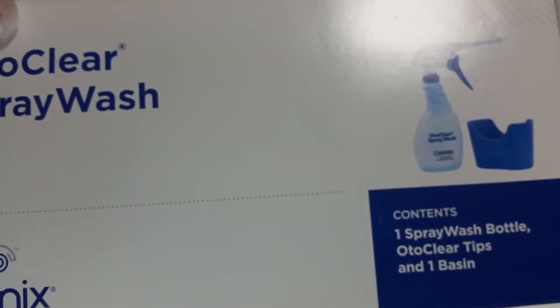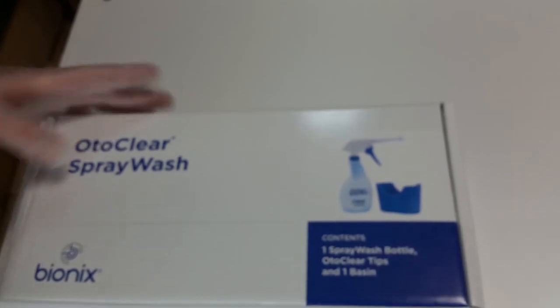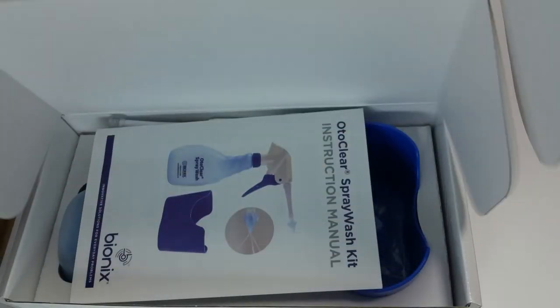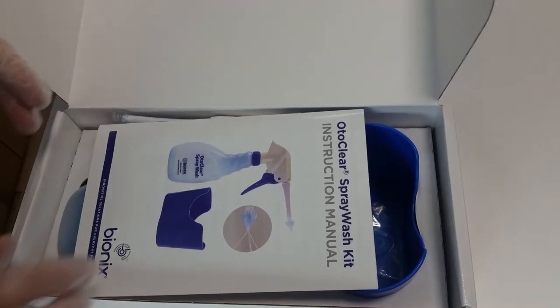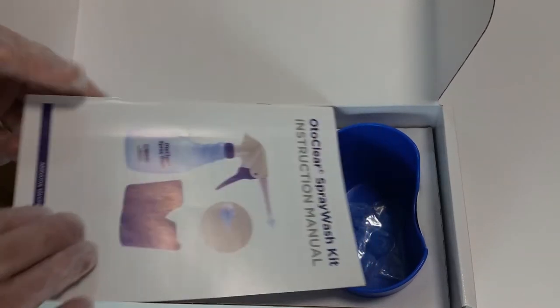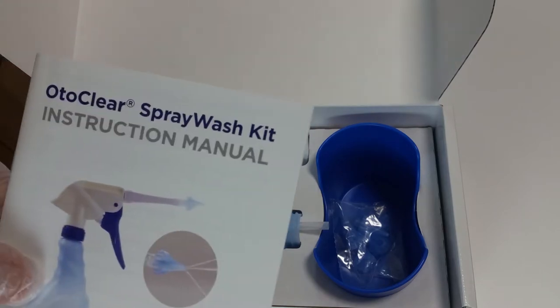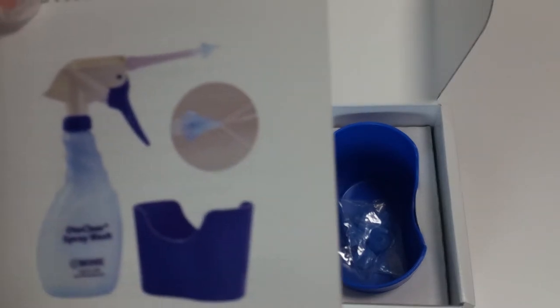It contains a spray wash bottle, tips, and a basin. If you open the box, the instruction manual is right on top. It's a really useful guide with detailed instructions about the use and maintenance of the kit.